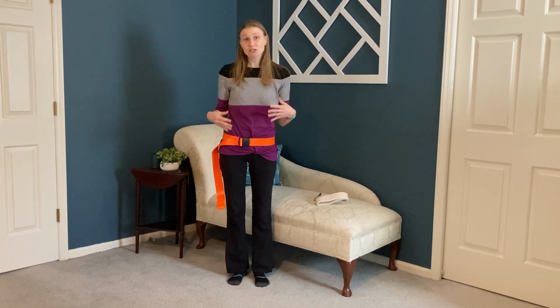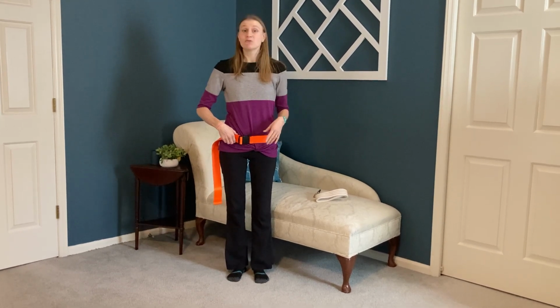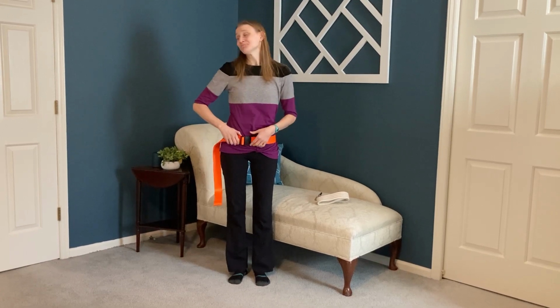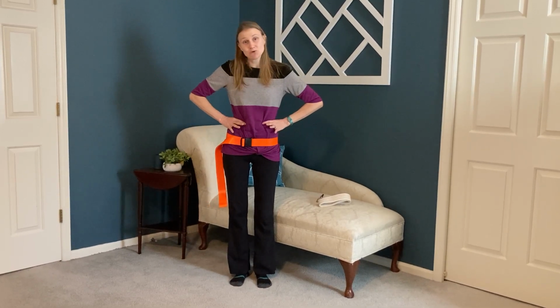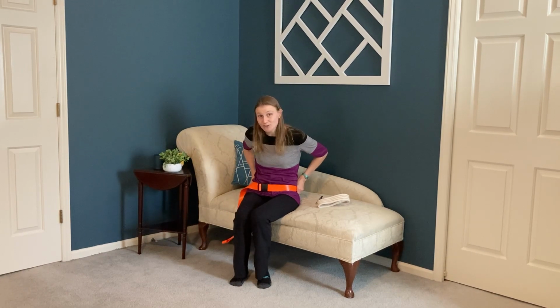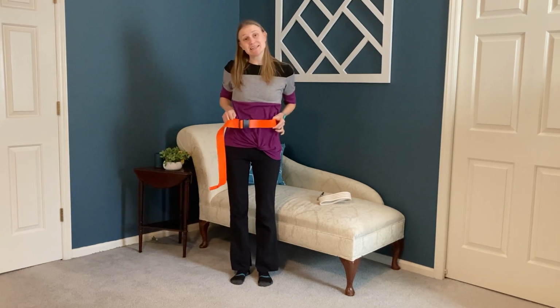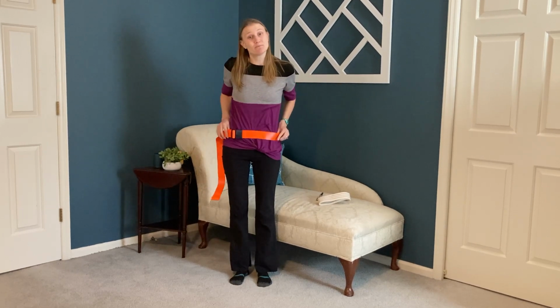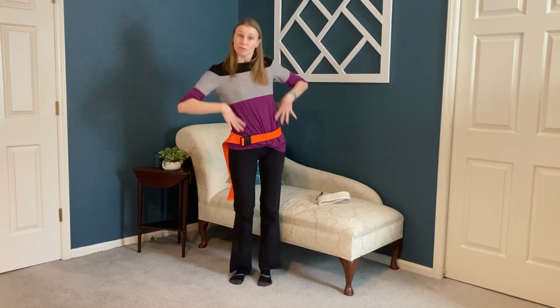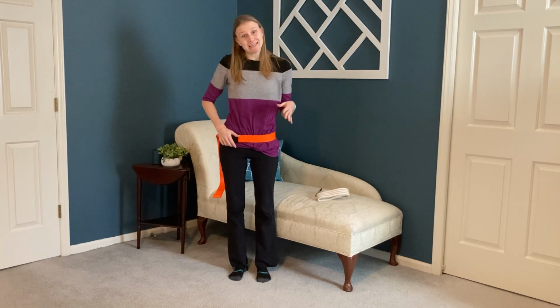The reason that I say low and tight is if you are using this gait belt for any kind of transfer, where you're going to be doing any amount of lifting, and I sit down and someone's going to help me lift, and we lift on 3, 1, 2, 3, lift, no matter where that gait belt is and how tight it is, the tendency is going to be for that gait belt to ride up. With female patients, we want to be sensitive. When that rides up, it comes into a sensitive area. Get that gait belt as low and tight as possible.